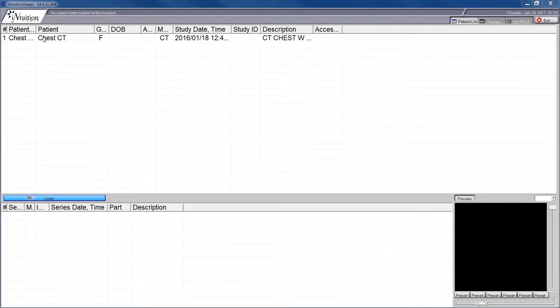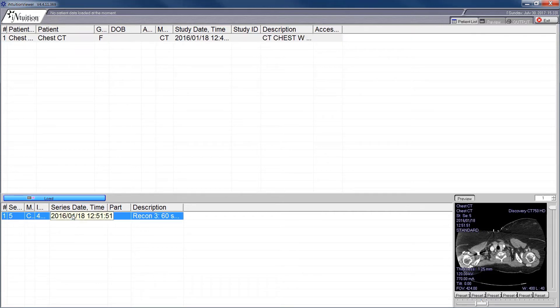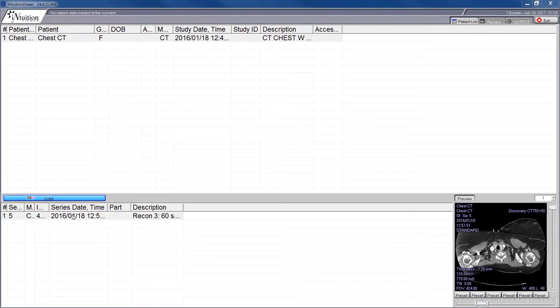Click on patient number one — the chest CT — and you will see that there is one series that pops up for this patient. Go ahead and double-click on the scan.